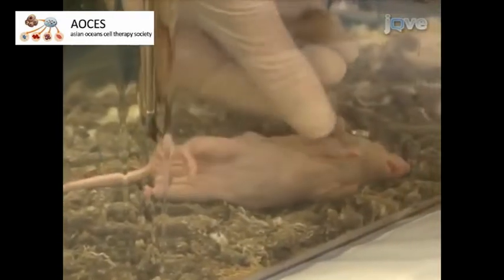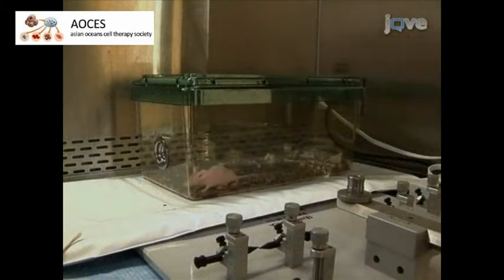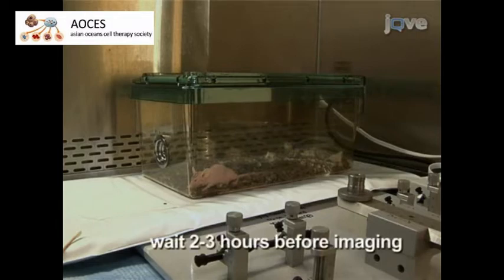Place the mouse in a cage on a heating pad to avoid hypothermia. Do not house the recovering mouse with other active mice. Monitor the mouse post-operatively until it regains consciousness and mobility. Due to the length of the procedure, it may take up to an hour for the mouse to regain full activity. If imaging will be performed, it is best to wait 2 to 3 hours.